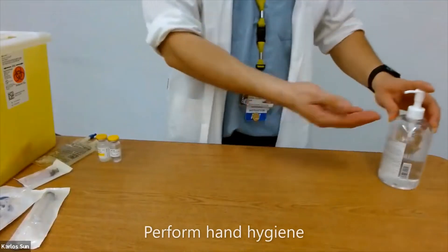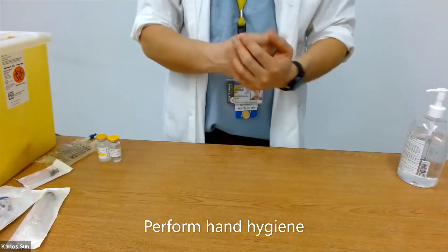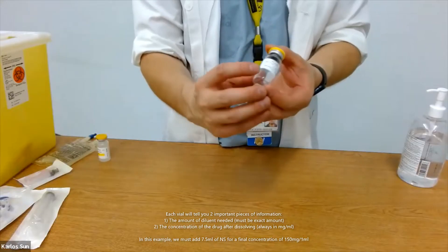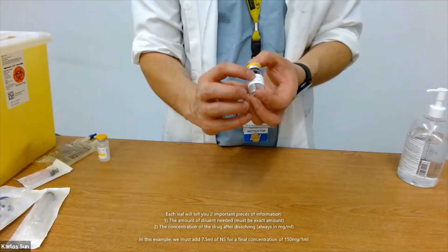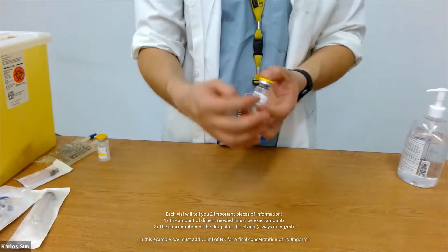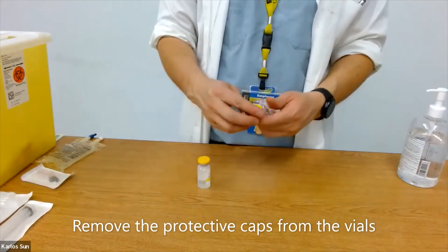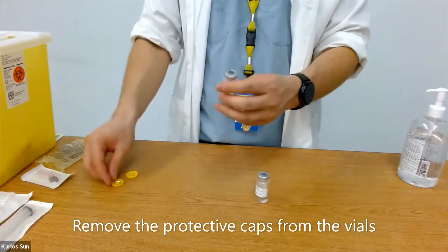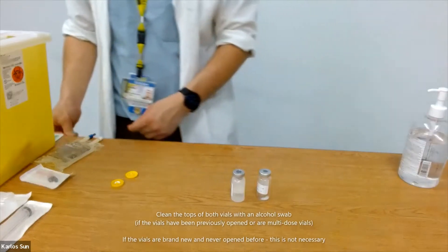Perform hand hygiene. For each vial, pay attention to the amount of diluent needed to be added, which must be exact, and the concentration of the drug after dissolving, usually in milligrams per milliliter. Remove the protective caps from the vials. Clean the tops of both vials with an alcohol swab.